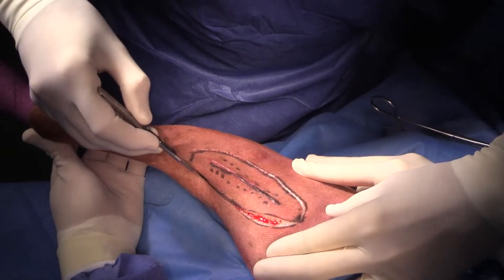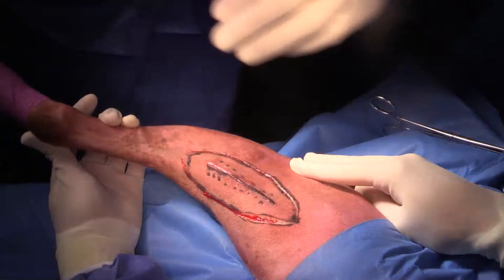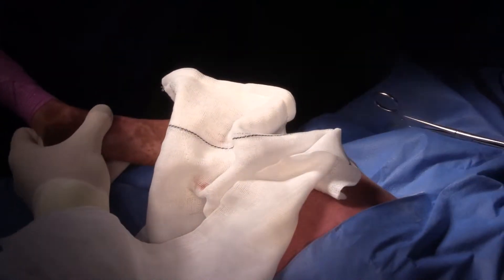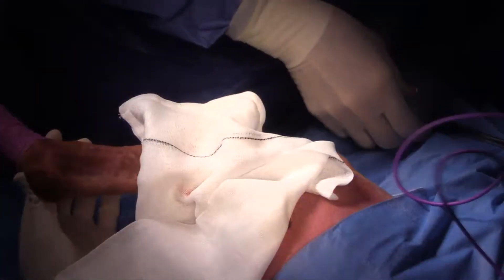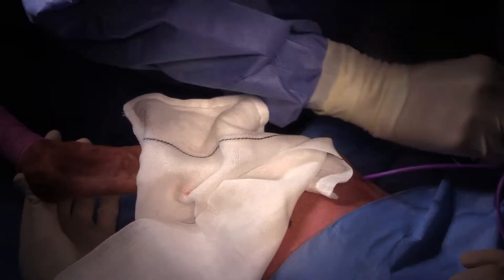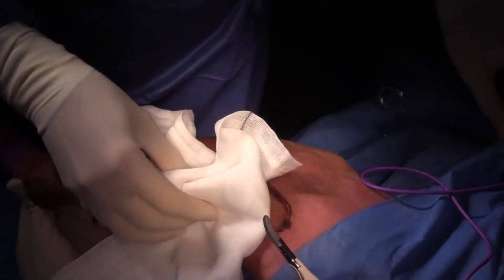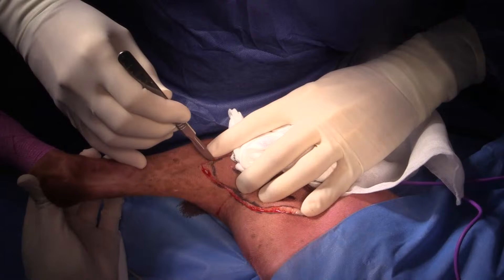So when you're recutting a surgical scar, it doesn't matter where it was dirty. Even if they told you it was dirty at one end of the incision, you have to make sure you've recut the whole surgical scar as if the whole thing was contaminated — because technically it is. When you have a recurrence of a tumor, often you'll have recurrence along the whole previous incision, not just in the area where it was dirty.